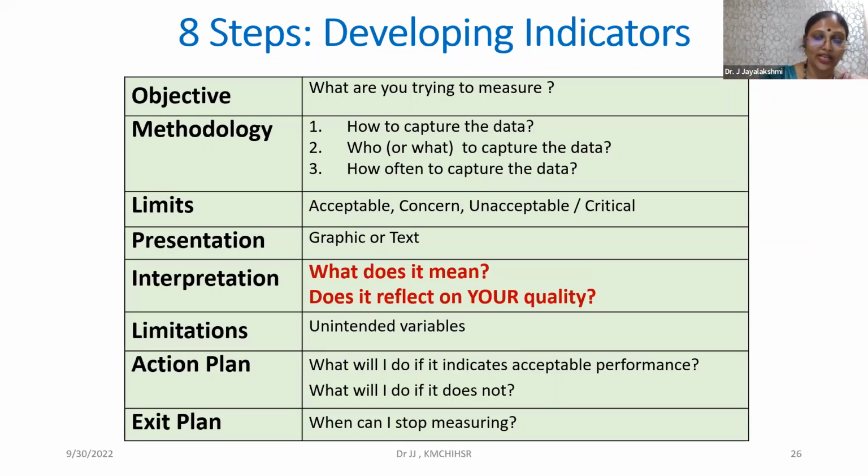Okay, I can tell you of my experience of handling this blood culture contamination. We did it as an audit. In fact, one of the postgraduates did it as a requirement of a clinical audit. The rates were higher, and when we tried to put the captured values on a map to see which areas they were coming from, we found that the emergency department and certain areas in the hospital had higher numbers, like 13%, and some areas were only 1 to 2%. The ICUs were fantastically doing very well with 1% or so. When we put them all together, it came up to 8%.